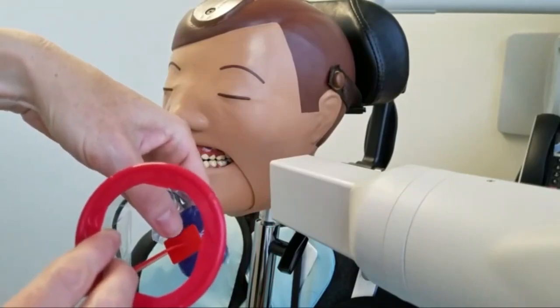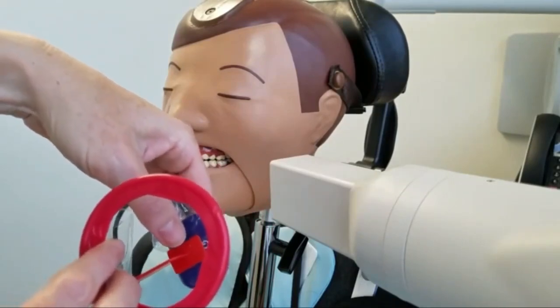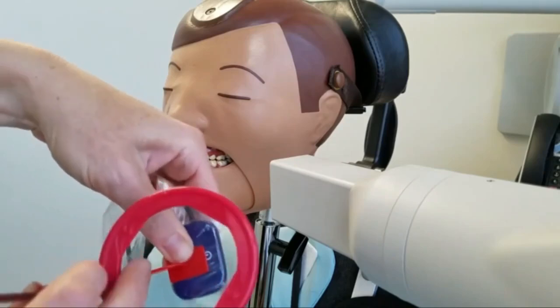The panoramic technique originated from the need to image the jaws, but it was also applied to other anatomic regions before CT became available. Panoramic radiography is an essential element in oral radiology today.